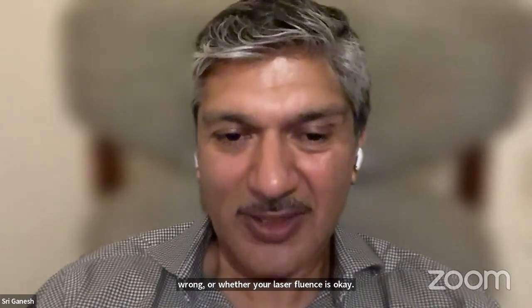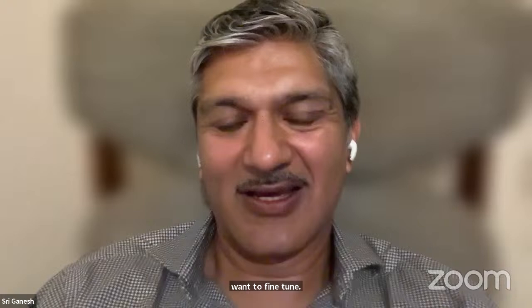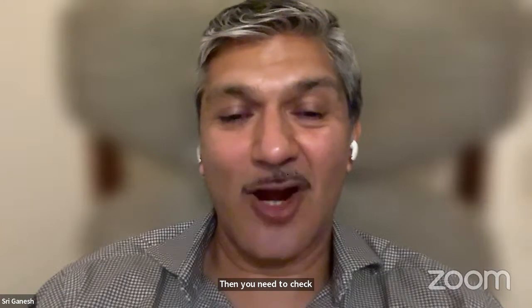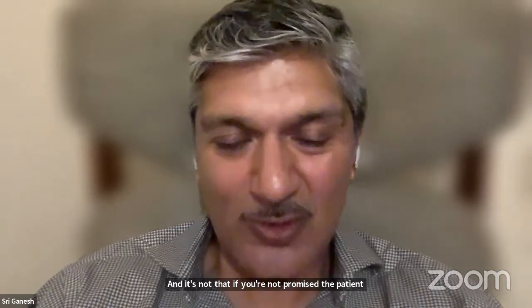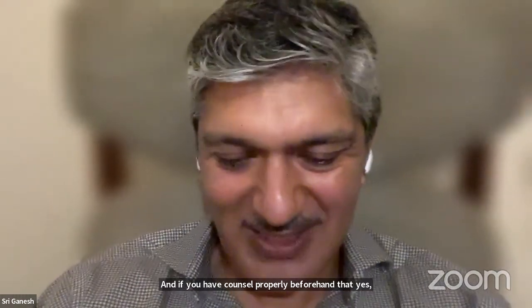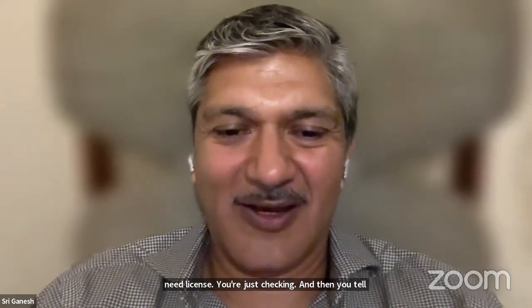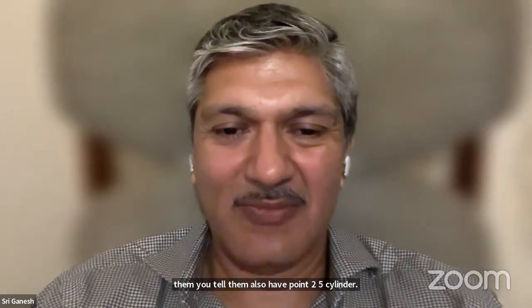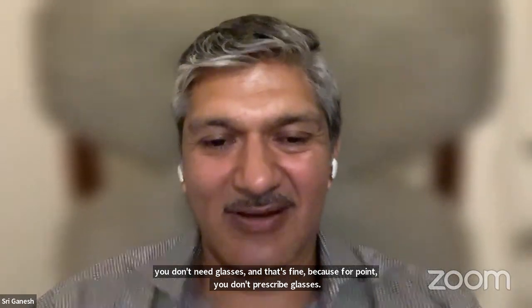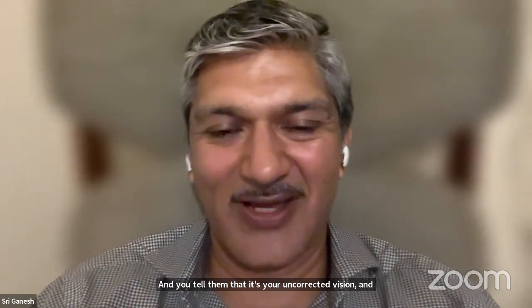So if you want to give the best results, if you want to fine-tune your laser and your results, then you need to check monocular best corrected vision. And it's fine if you have counseled them properly beforehand that it's plus or minus 0.5, we're just checking. You don't need glasses, we're just checking. We also tell them, you have 0.25 cylinder, but you don't need glasses. That's fine, because for 0.25, you don't prescribe glasses. And you tell them that it's your uncorrected vision, and whether your vision is good enough to do all your normal tasks, and they are fine with that.